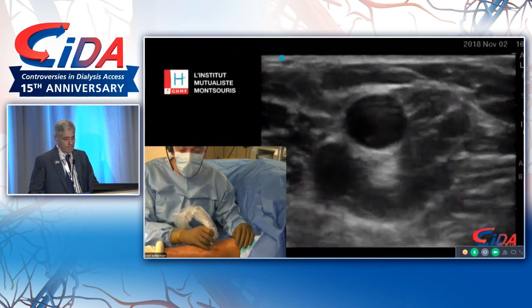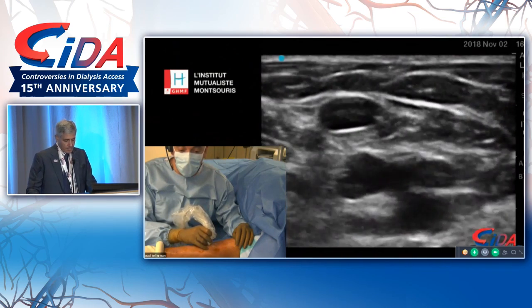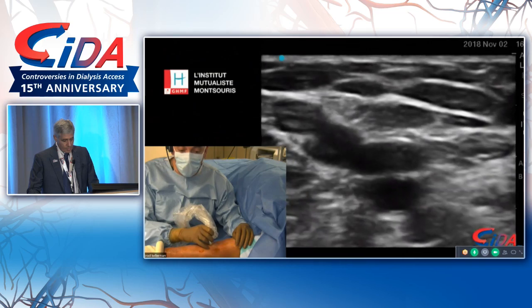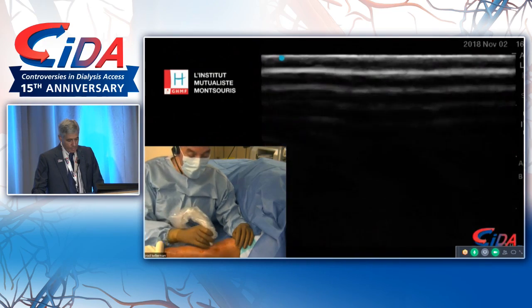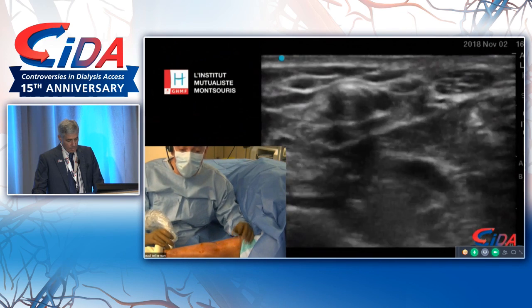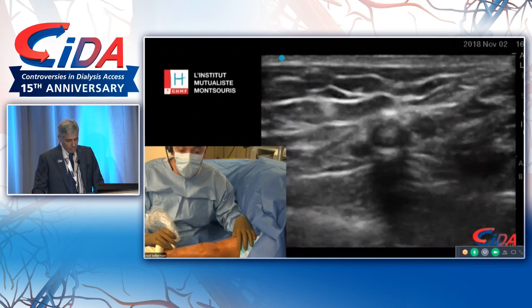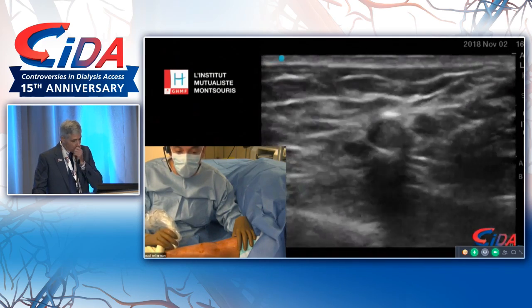And what you will see here is the perforator going down to meet the proximal radial artery after the takeoff. This is the brachial artery here, and the bifurcation with a larger radial artery and a smaller ulnar artery here. Of course, lots of people might ask why not do a distal. So, for example, this patient, and this explains why distal fistulas fail in diabetic patients. You see this horrible calcified artery, which is perhaps the most important reason of failure for diabetic patients.